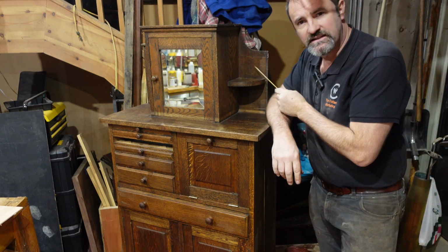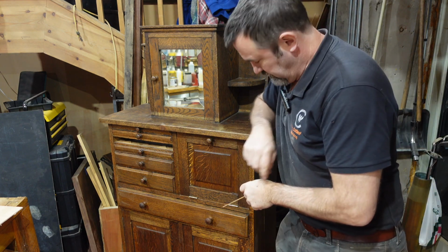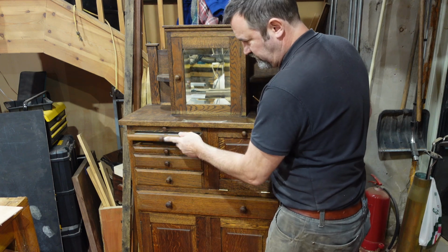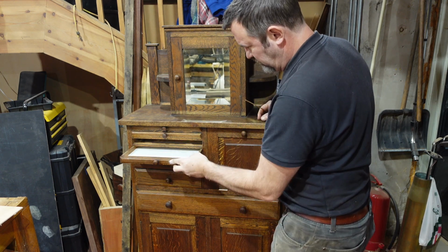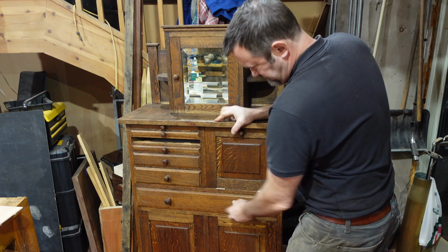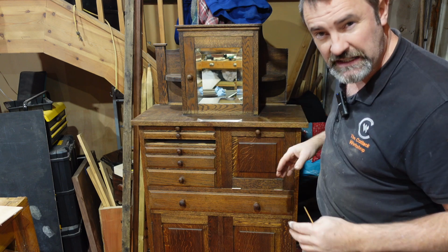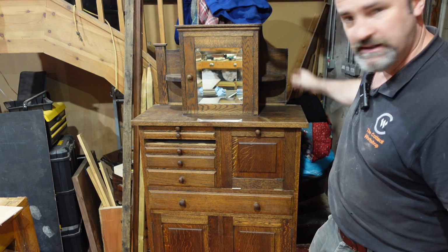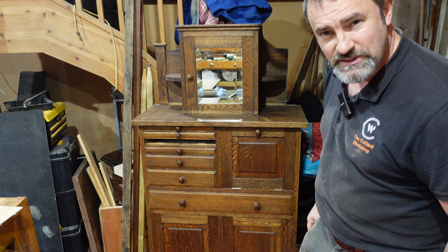So it's coming on. I've taken the clamps off here and that's looking a lot better. We turned those handles to make them a little bit better. I've got one more drawer drying, but now these are fitted. Need a little bit more sanding on a couple of them. That one in particular. This drawer doesn't quite fit yet. The next stage is going to be to put some wood stain, just oil, back into it, because there are sort of patches on it, and that's going to make it really pop. I've got to fit in the piece that we took off here. Got to wait for that to dry, put shelves in, and get ready for the final stages, but really getting there.